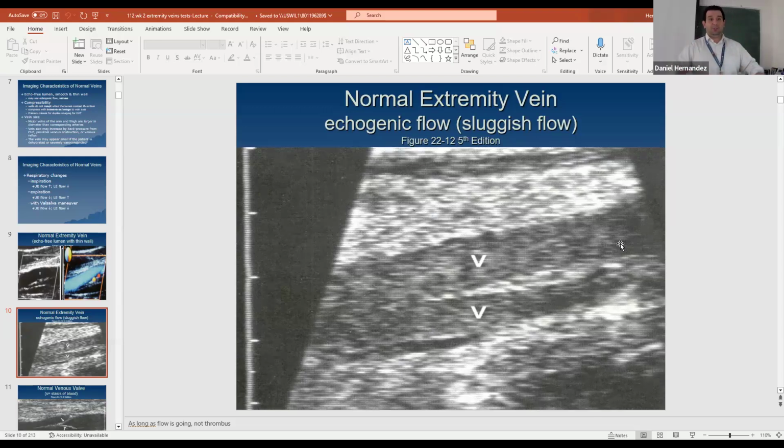And I could see the blood flow just kind of smoking and swirling, but it was negative. Everything was able to compress, even though it took a lot of pressure to compress those veins. But I mentioned it to the doctor, she's got this Rouleaux formation, this slow flow. Maybe you should tell the doctor about this. Maybe she needs to go on some sort of anticoagulation temporarily while she gets to the end of her pregnancy. It's probably due to those twins pushing on the IVC, pushing on the iliacs, compressing the vessels, causing this.